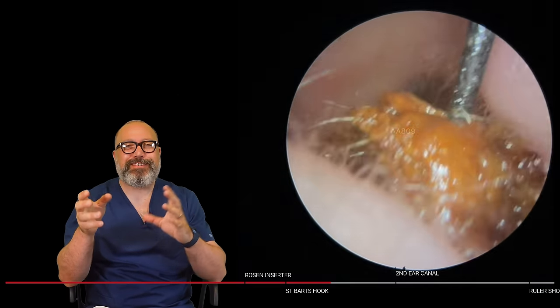My advice to this patient, as with a lot of patients really, is to use a bit of olive oil in there just to keep everything nice and soft, keep everything working down the canal, stopping that skin from drying out, stopping the wax from sort of hardening up. Sorry, I lost my train of thought there for a split second. So we're just trying to move this plug down the canal now. Still giving this a little bit of a wiggle.